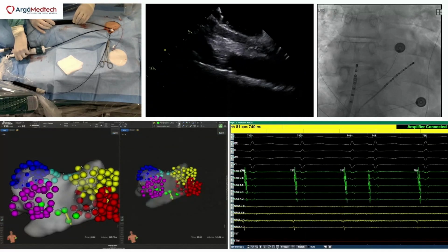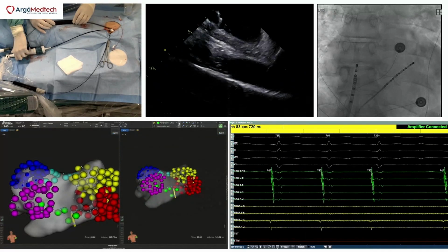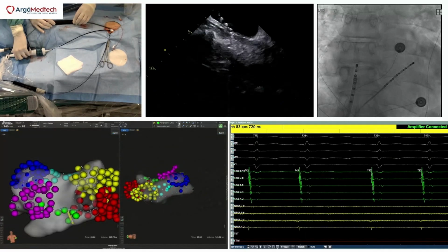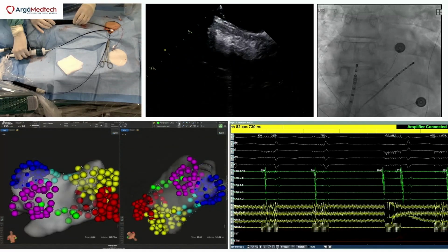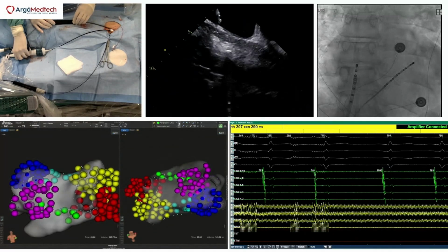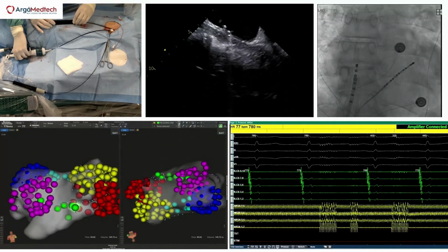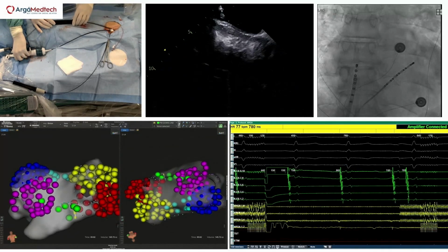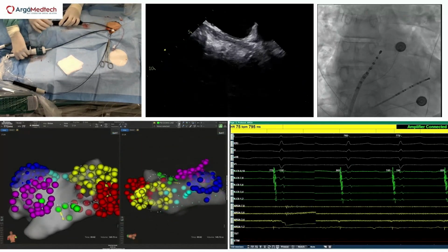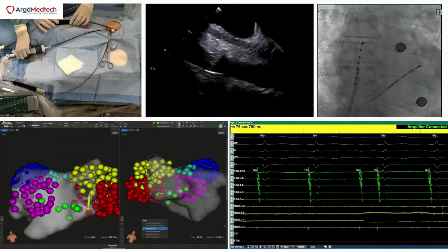Okay, Antonio. Just here. Point. No, wait. Point. Go. Good contact there. So we get approximately 1 centimeter wide lesion here, and it's at 3 or 4 millimeters, still 1 centimeter. Now, I want to do high output pacing from the posterior wall. I'll drive the catheter to the mid posterior wall, and let's see if we have isolation or not.